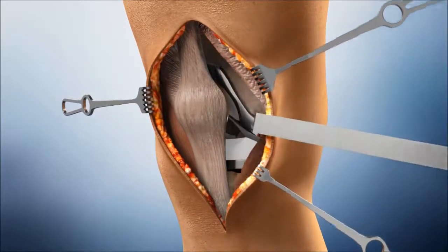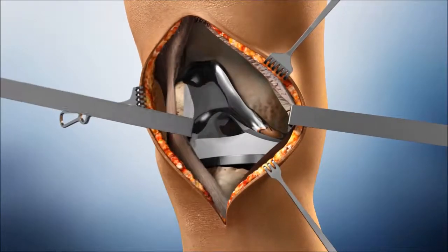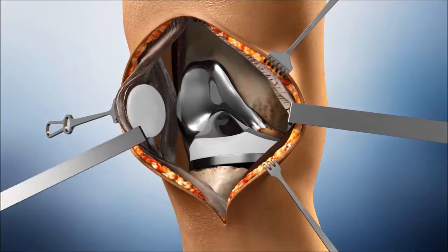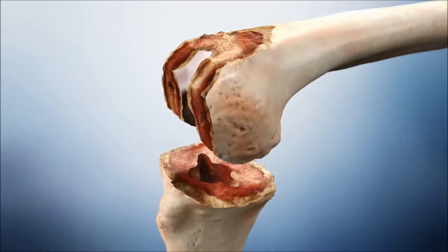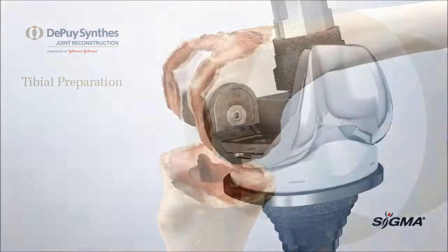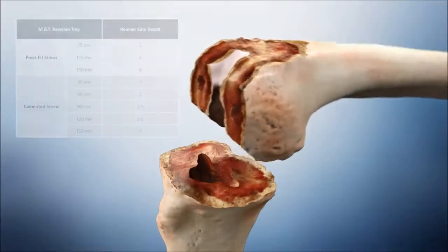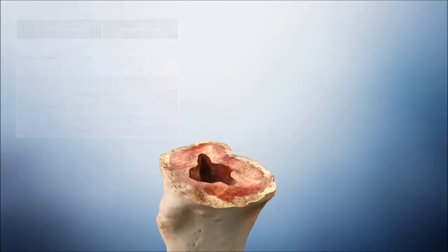Remove the implanted components, being careful to preserve as much bone stock as possible. Once components are removed, with the knee in flexion, begin tibia preparation for MBT revision. Use the tibial reamer depth chart in combination with the MBT revision reamers to prepare the tibial canal to the appropriate depth. Progressively ream until cortical chatter is achieved, being sure to stop on an even diameter reamer.